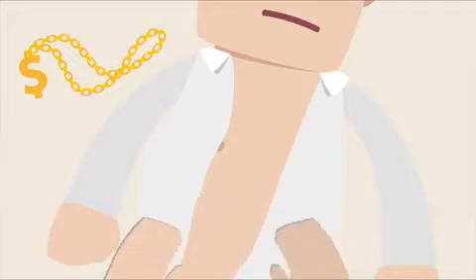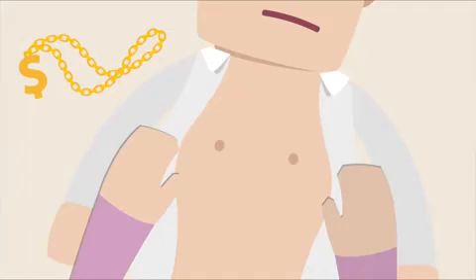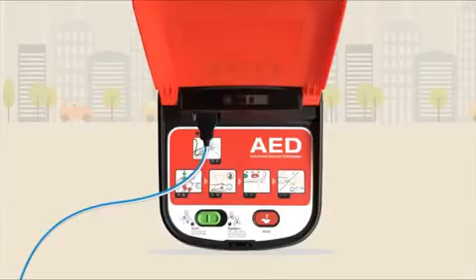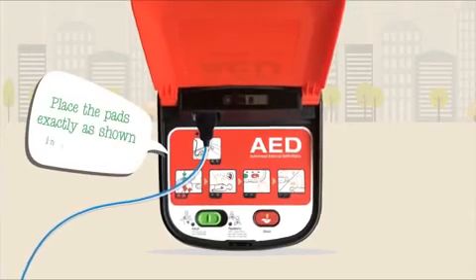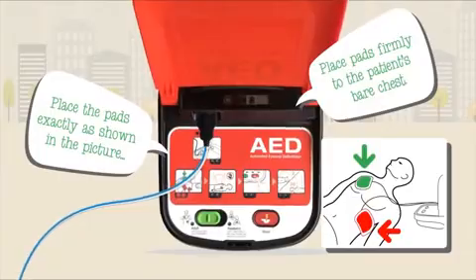Make sure to also remove anything that may contain metal, like jewelry and bras, as metal conducts electricity and can cause burns. Remove the foil packet on the pads and select the option for adult on the front of the unit. You will then be instructed to place the pads exactly as shown in the picture, pressing them firmly to the patient's bare chest.